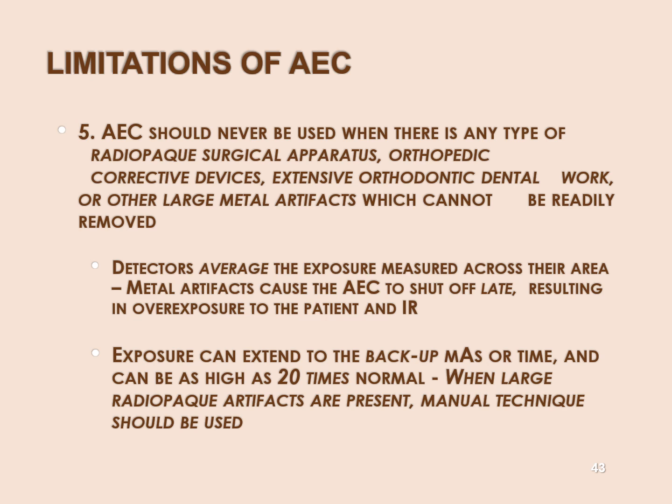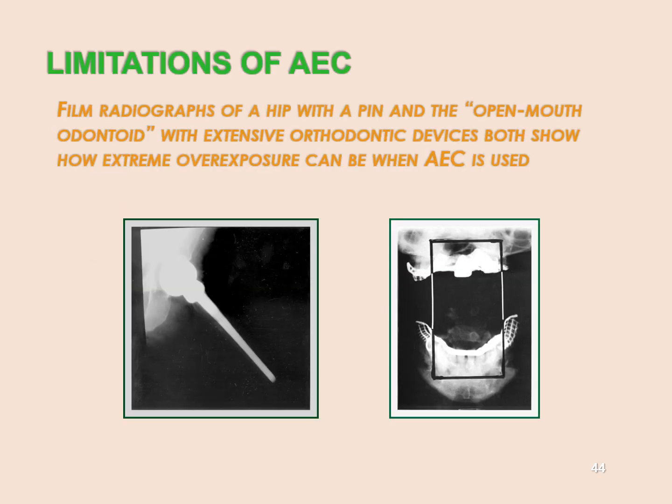But something the size of a complete total hip replacement, oh yeah, it's going to affect the AEC. Okay, so just use manual technique for that. So there you go. There's an example of an artificial hip being phototimed or using AEC. And then here's the other one, the AP open mouth.